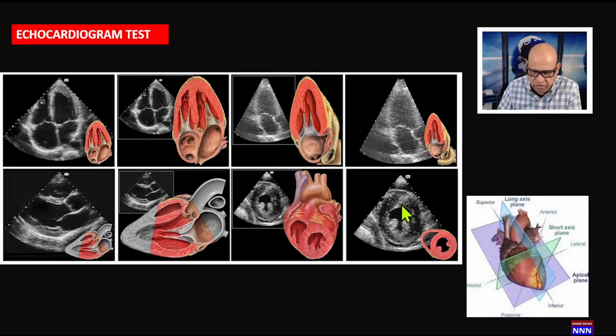heart. And here's the short axis showing the left ventricular cross section of the left ventricle. We don't see the right ventricle, and here are the papillary muscles. We'll exactly know every structure and the anatomic name of each one of these sectors in the next several slides.